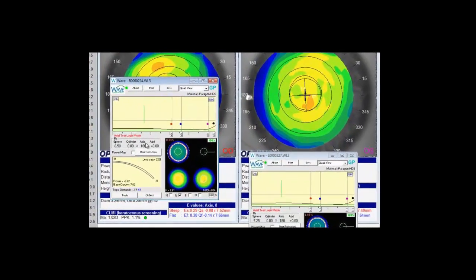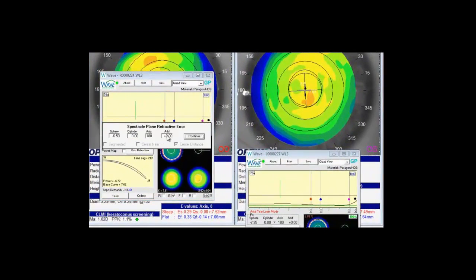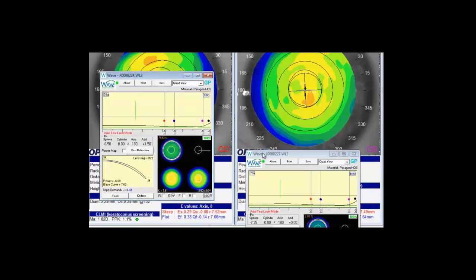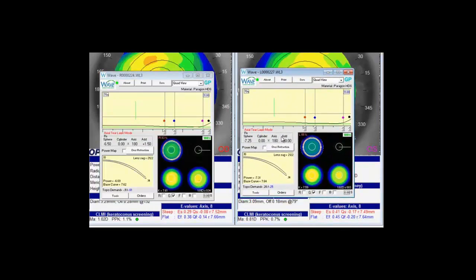And to incorporate a multifocal we simply click on the RX box and plug in the appropriate add power. So here I'll put in a plus 150 and I'll choose center distance. It's for the right eye and do the same exact thing for the left eye.